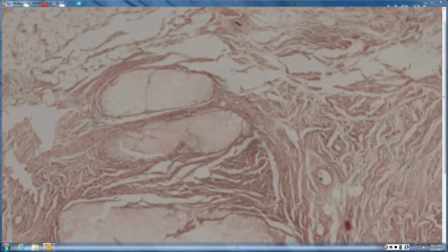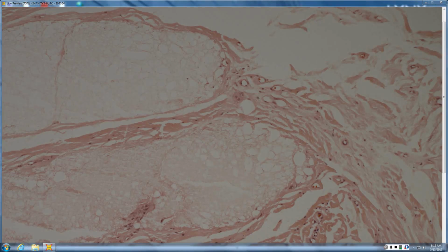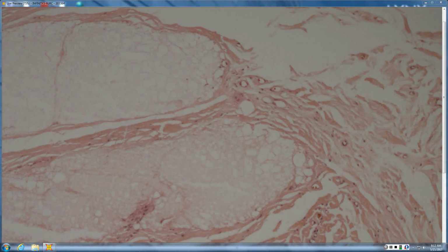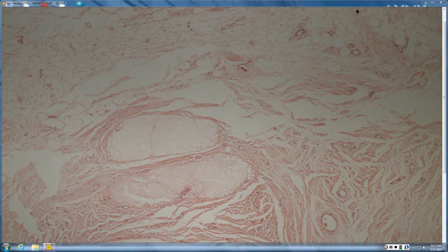Piece of tissue, possibly some exogenous material. Yeah, kind of granular. Deposited here. So tell me about the inflammatory reaction to it. It's not that brisk or robust. Yeah, or not present at all. So a big hunk of granular foreign substance that's not inciting any inflammatory reaction whatsoever. Kenalog. Yeah, that's exactly what it is. It's Kenalog. So, it's actively suppressing the inflammatory reaction, and that's what Kenalog looks like. You've seen it before in keloids and things of that sort.